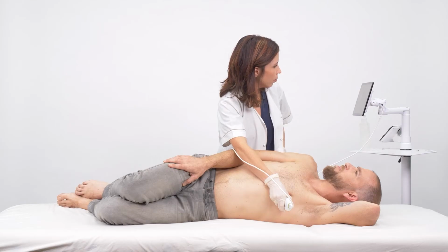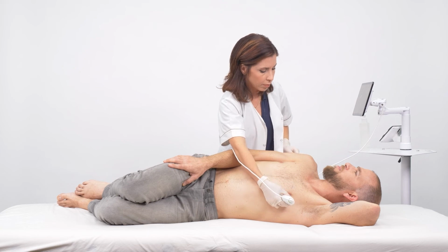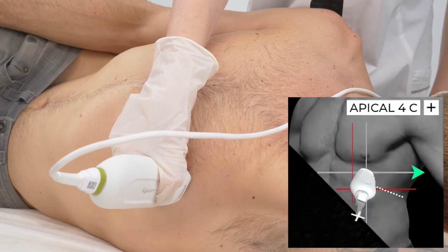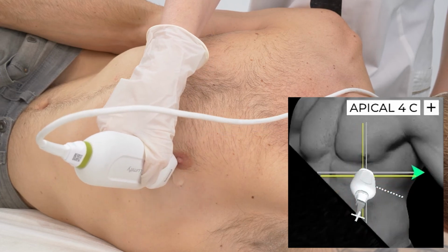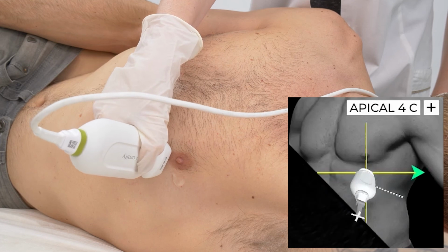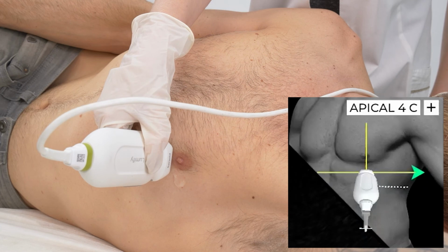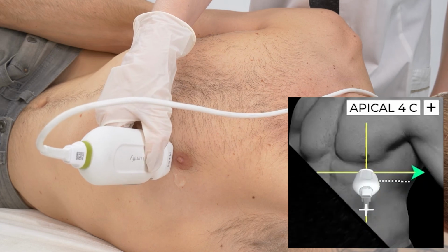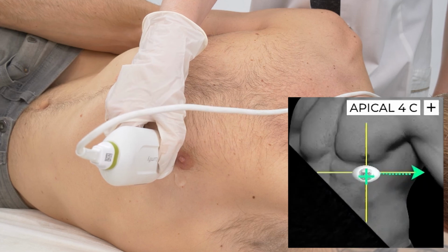Finally, let's look at an example that combines several instructions all at once. The first movement to be performed is slide, and users are directed to slide down and towards the left, towards the target axes on the screen. The next movement is rotation, and users are instructed to rotate the probe counterclockwise. The last movement is tilt, and the user needs to improve the probe's angle in order for the probe to be perpendicular to the target axes.